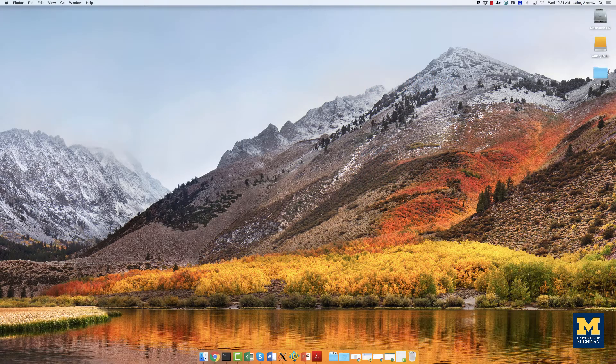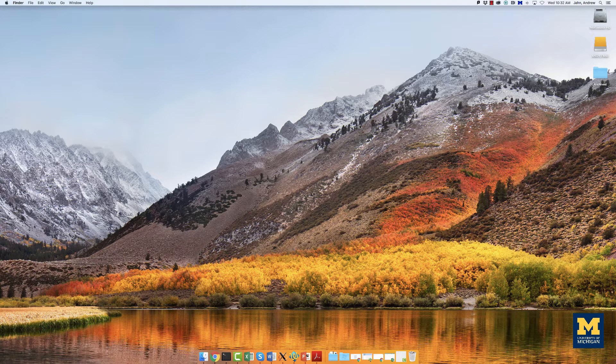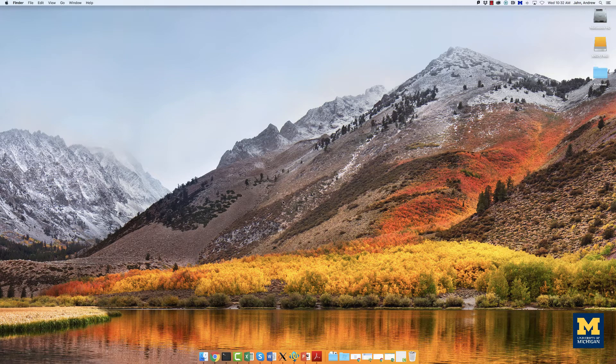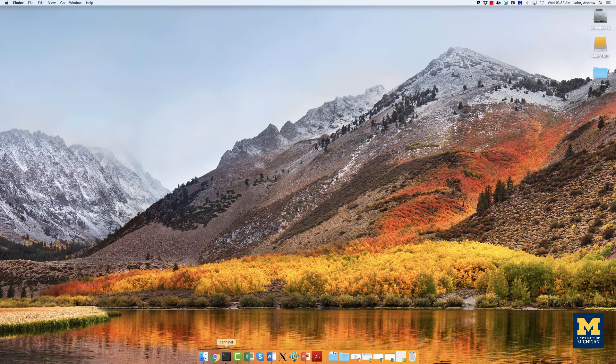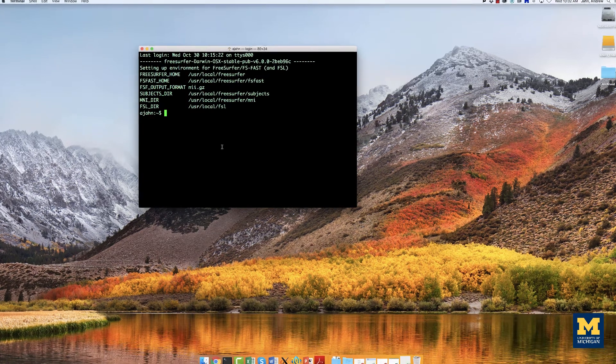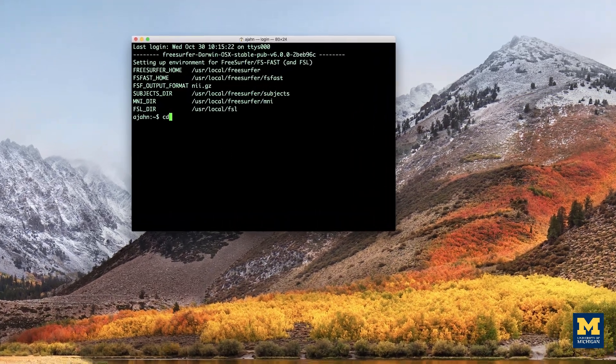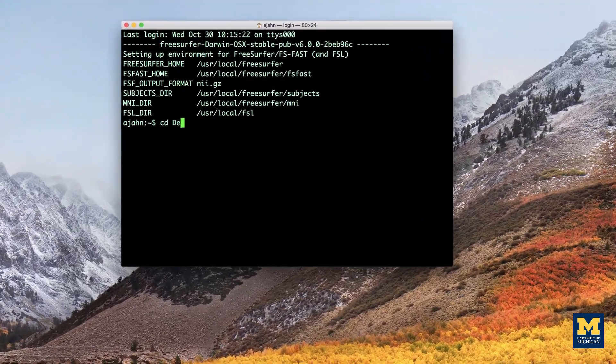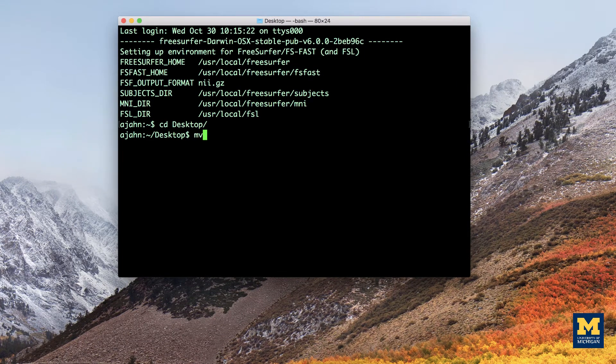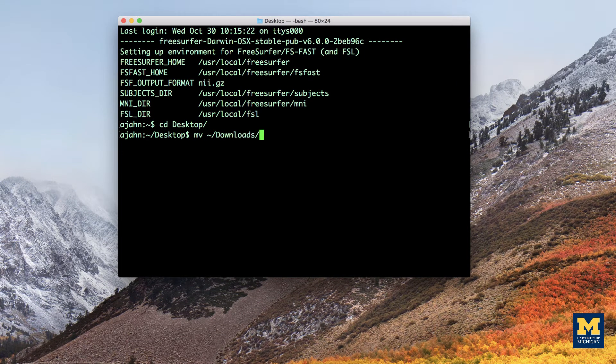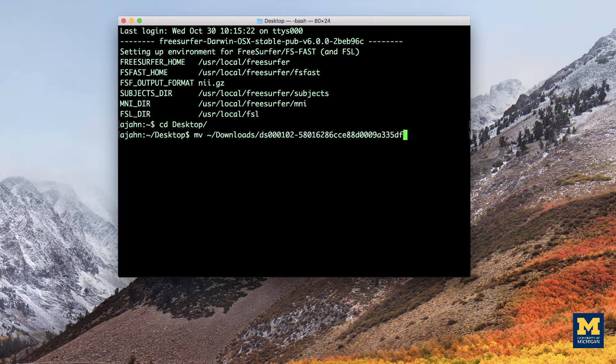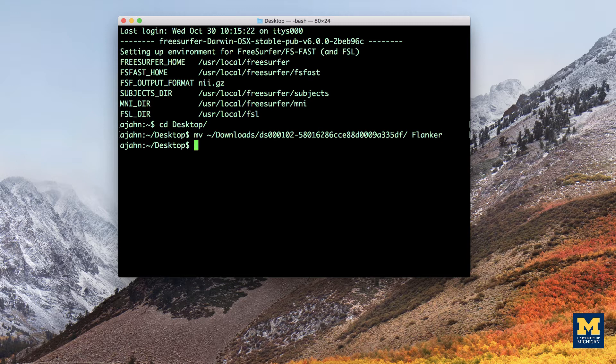Let's first rename the data set to something that is clear and informative. If the data set has been downloaded to your downloads directory, open a terminal, navigate to the desktop, and type the following: the move command, followed by tilde slash downloads slash the name of the folder that you downloaded, and then Flanker. This will rename the folder to Flanker and put it on your desktop.